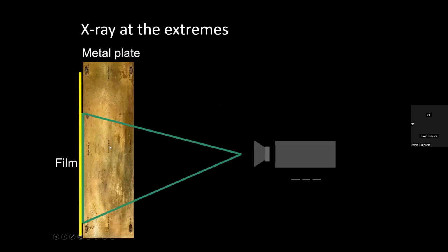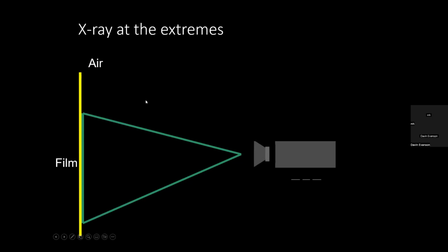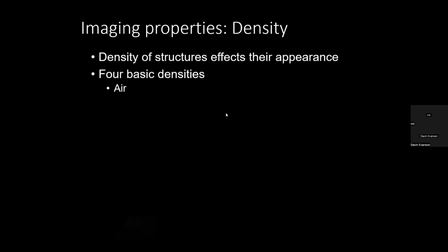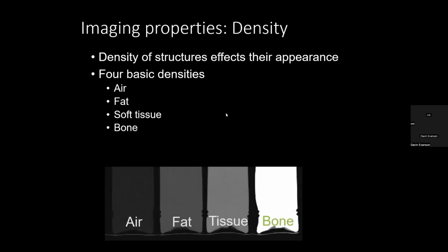So density, so this is metal. It all comes back to chemistry in the periodic table. A heavy element, tightly packed nucleus, will absorb the x-rays. None of the x-rays actually make it to the detector, and it will keep it white, radiopaque. X-rays, if they go through air, no problem, like the lungs, turn it black. And you can imagine somewhere in between, gray: black, white, shades of gray. There's air, fat, soft tissue, and then bone and metal.